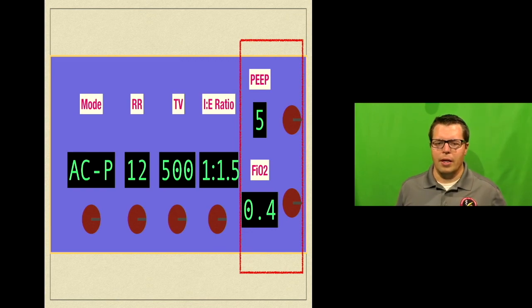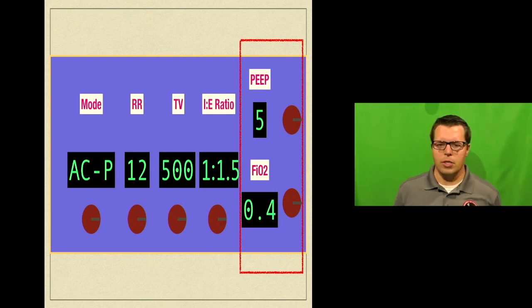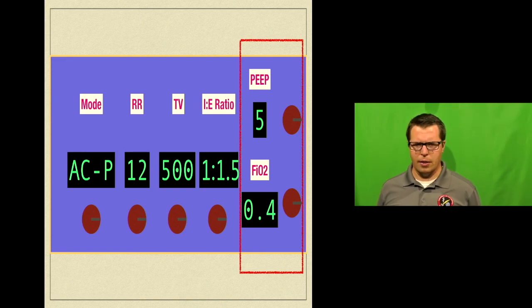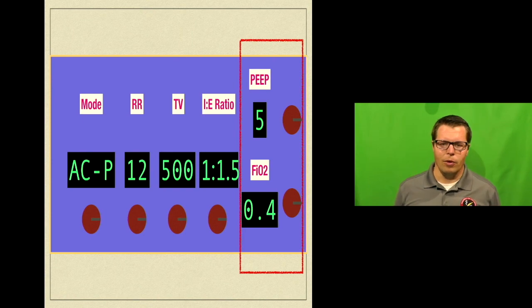And so when you start thinking about changing one of those, as you would, oxygen, okay, reach over. A lot of us are just going to reach over and dial that FiO2 on up to 100% first thing, or at least a little bit higher, and that's going to be our first move. And usually we forget about PEEP, or we choose not to mess with it. Somebody back there has told us at some point that if you put patients on a lot of PEEP, more than 10, you're going to explode their lungs and things are going to be terrible, and the inside of your aircraft or the inside of your ambulance is just going to be this big mess, like you slaughtered a hog because you gave this guy a big pneumothorax and then you got a lot of other problems. That actually will not really happen.